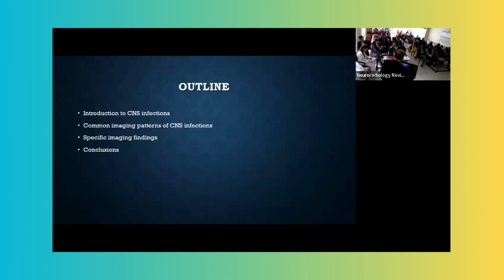What I'm going to do today is go through, in the next 20 minutes, some of the common etiologies affecting the brain in terms of infections, and also go through some of the common imaging findings, okay?